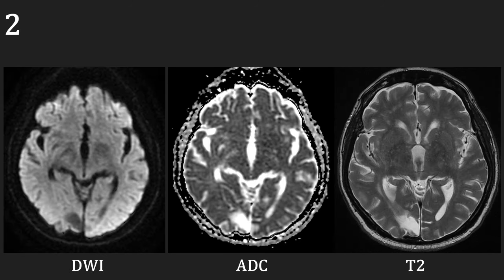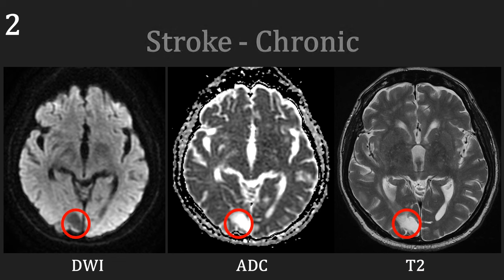In comparison, this is a 66-year-old female patient who is known to have had a previous stroke in 1998. Here, we can see on the DWI, in the right occipital lobe, there is an area of low signal, which is high on the ADC and also high on the T2. This represents a chronic infarct or an old stroke.